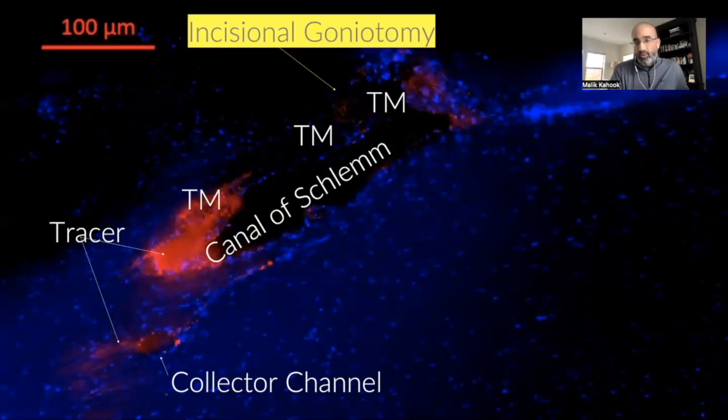In my hands, typically what we do with this device is the canaloplasty, where we do 3 different punctures at least, sometimes 5. We can do up to 8 punctures with this, and we inject viscoelastic over a broad area of the canal. There are other videos available online where you can see how far the viscoelastic goes, and we can get this viscoelastic to go 360 degrees, even when injecting just in the nasal angle, covering 90 degrees, 120 degrees. So there's a lot of flexibility, and you can tailor the therapy to the specific patient.